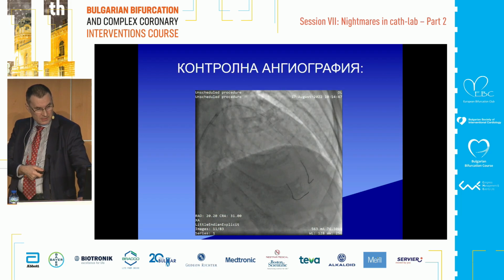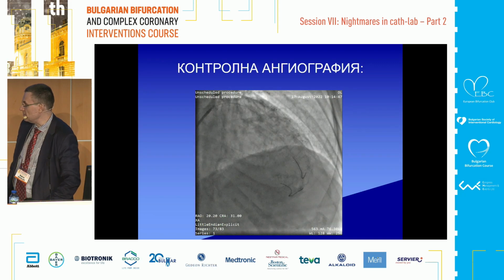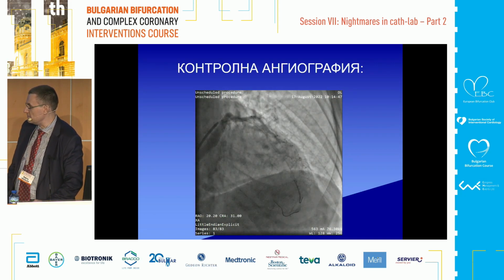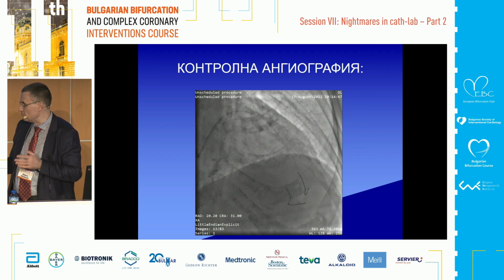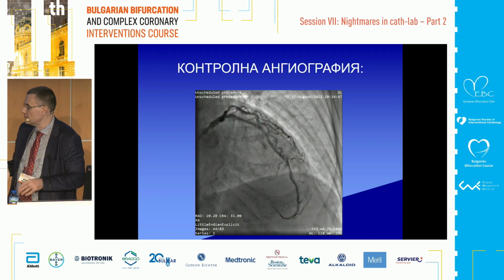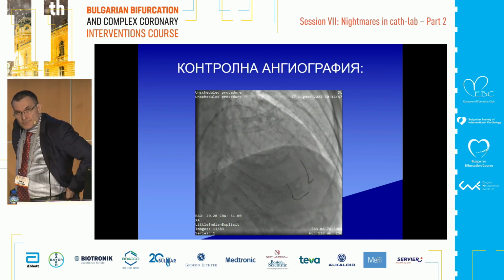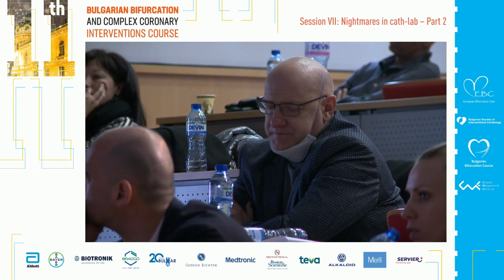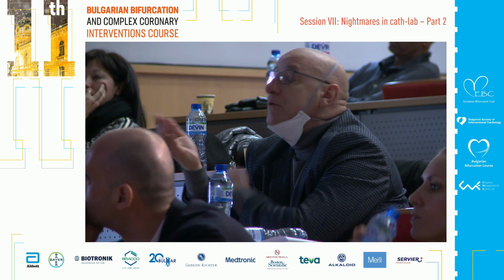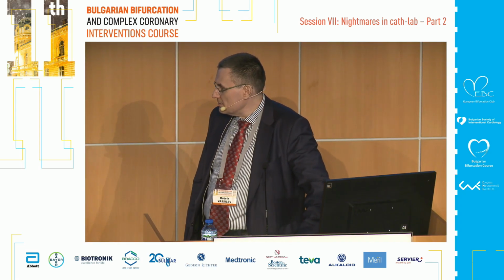That was the flow after dilatation in the subintimal place, and here the patient was stabilized, and then you have some time to think what to do further. These subintimal spaces are connected and you can see there is a flow to the side branches. That's something which is very important. Actually, there is a flow to all branches in this whole septal set.